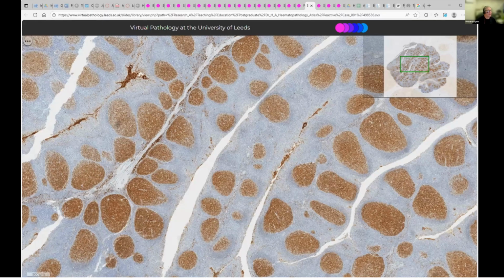Mixed cellularity Hodgkin's. Okay, so mixed cellularity Hodgkin's tends to have relatively large numbers of classical Hodgkin cells, including Reed-Sternberg cells. I think that's the main feature of mixed cellularity Hodgkin's, relatively easily identifiable Reed-Sternberg cells. Probably not a great differential for mixed cellularity Hodgkin's with classical features. I'm not sure I can help you much more on that question. I hope that was helpful. Probably not entirely helpful.